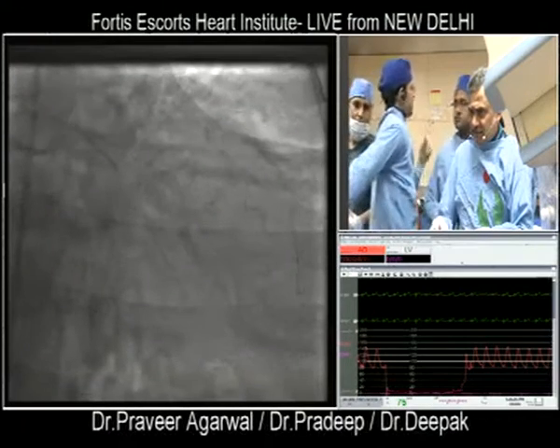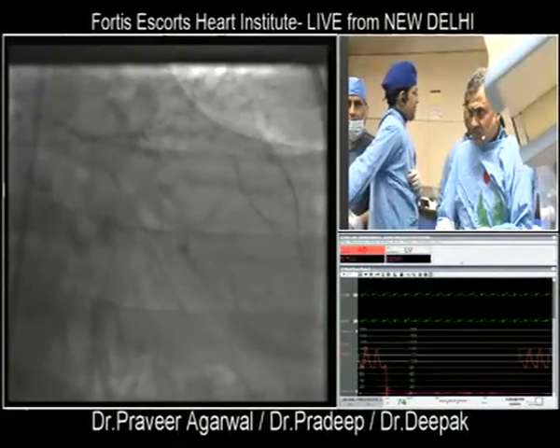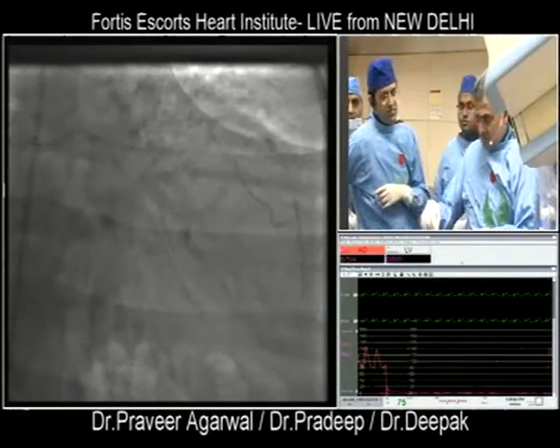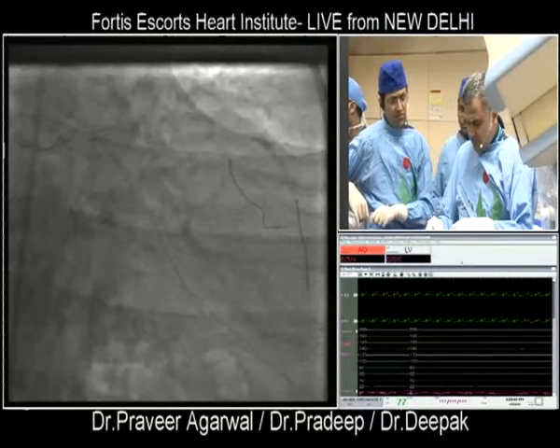Can we have another wire, please? ACT. Another Allstar, please. Or give me a BMW.